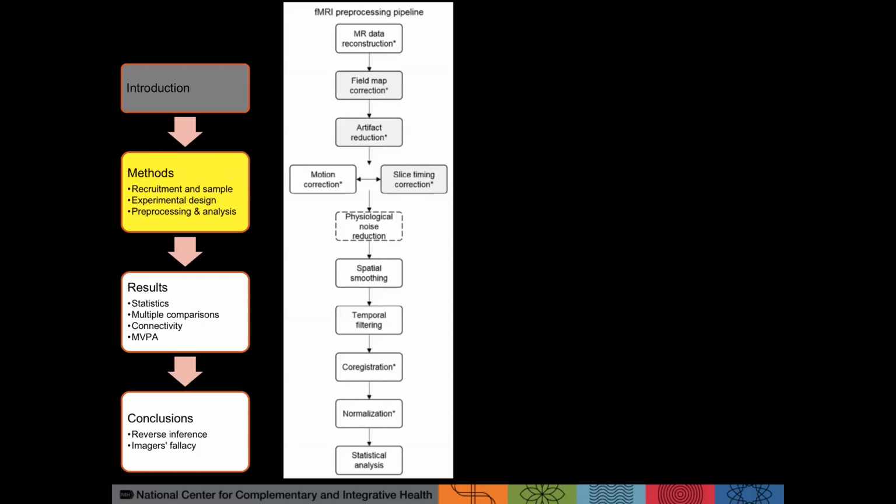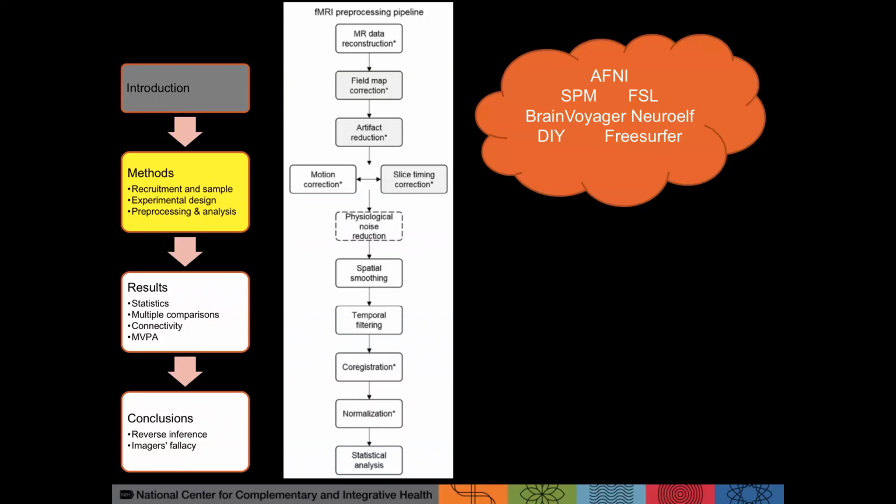So once you have fMRI data, before you can do statistical analysis, you have to do a whole series of steps called pre-processing. And I'm not going to walk through all of the steps, unfortunately, because we don't have time. I already talked a little bit about motion correction, but there are many decisions along the way that help get you from raw data out of the MRI scanner to the point that you can actually look at the relationship between the brain data and your activity.